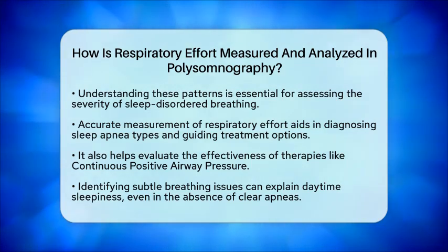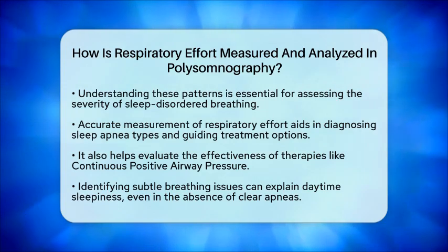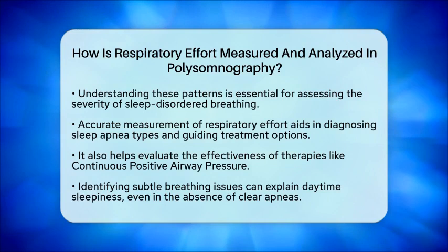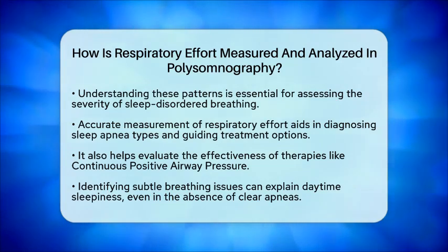In summary, respiratory effort is primarily measured using chest and abdominal belts in most clinical settings, while esophageal manometry is reserved for special cases. Analyzing these signals allows healthcare providers to differentiate between obstructive and central events, ensuring a thorough assessment of your sleep health.